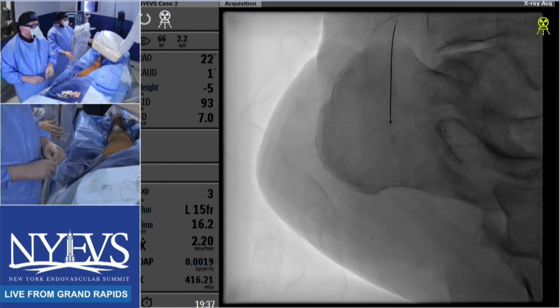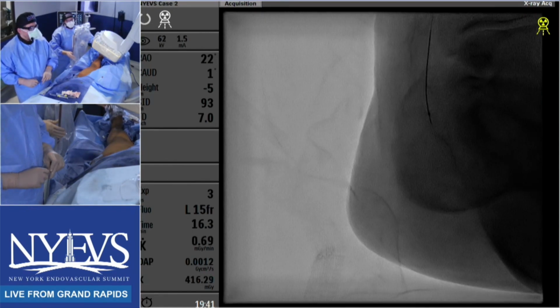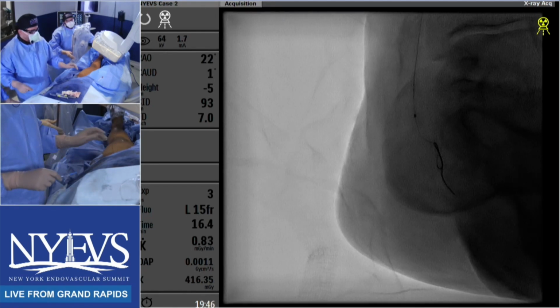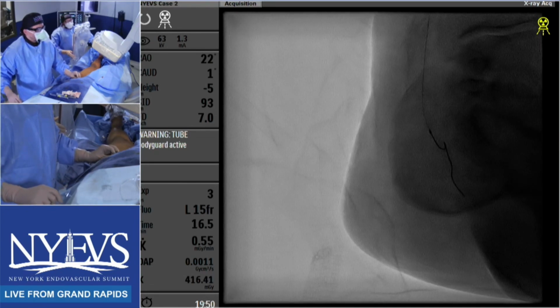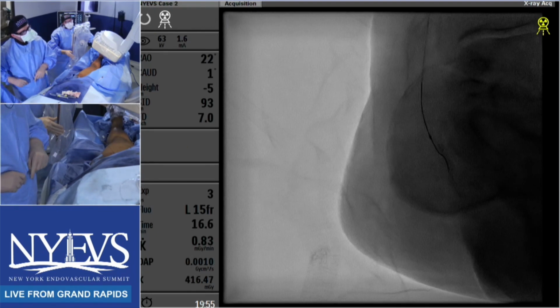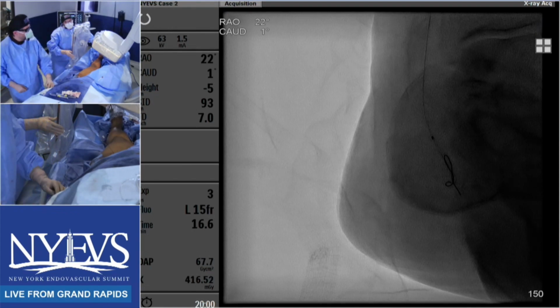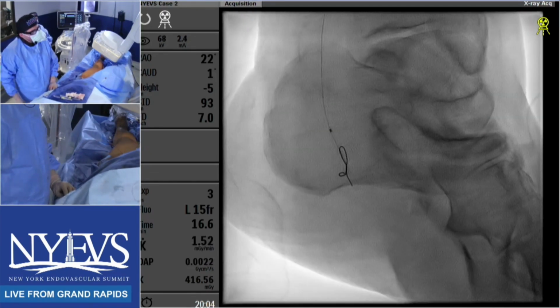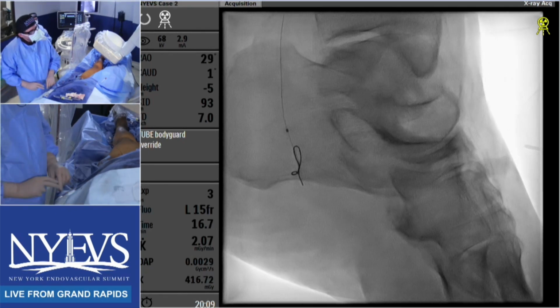Yeah, let's try that again. Kaylin is flexing the wire again. There we go. Watch your knee, Kaylin. So it's going into what, Eric, I think is the lateral plantar branches. Right there. Vishal, do you guys do it any differently? Is this your primary technique if you're treating these below ankle vessels? Anybody on the panel do anything differently?